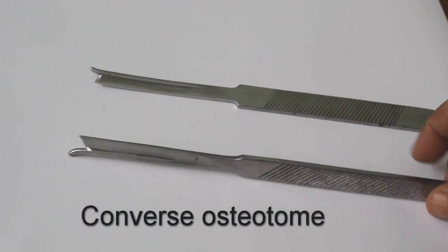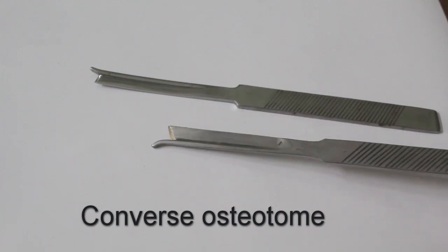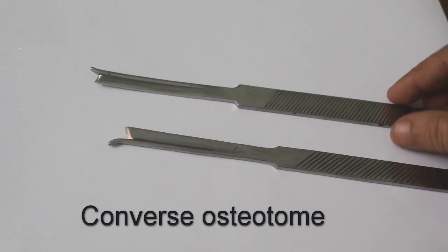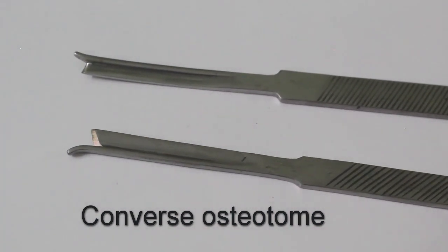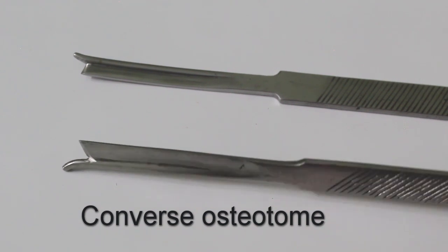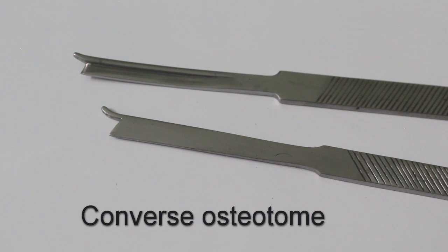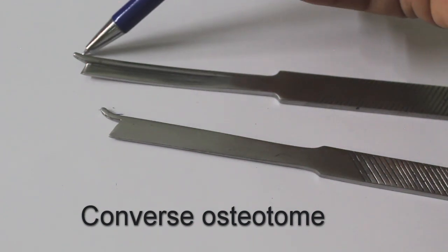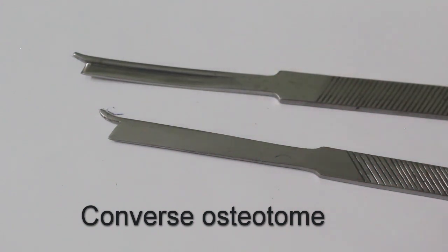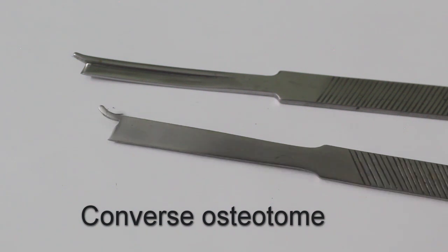This is a guided osteotome for extra protection. See the tip — there is a guide for the right side and left side separately. This guide is protective: it ensures the osteotome will not go beyond a specific length, giving protection while doing the osteotomy. These are guided osteotomes.